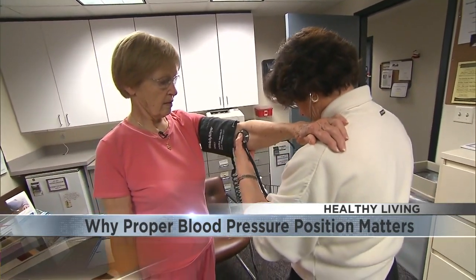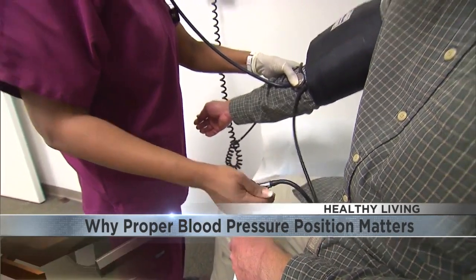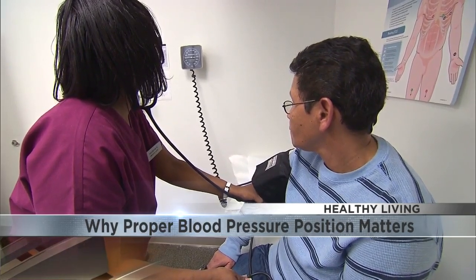At a doctor's appointment, it's one of the first things you have done. Knowing your blood pressure is a critical part of health, but researchers say some readings may not be right. In order to diagnose hypertension, the first step is getting an accurate blood pressure measurement. Inaccurate measurements, whether in the clinic or in the home, can lead to misdiagnosis or either over or under treatment.